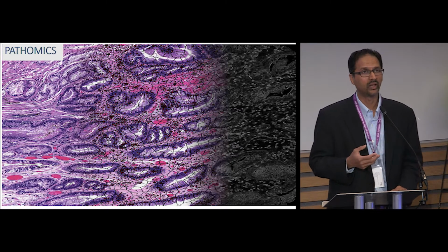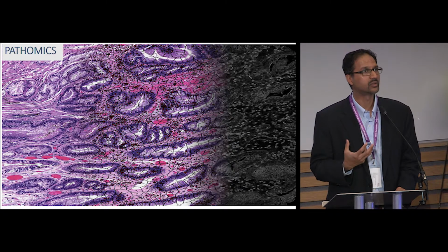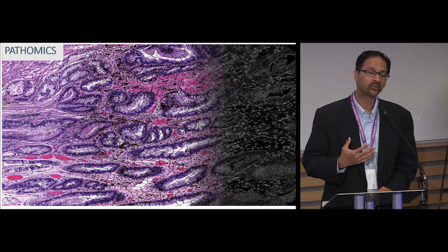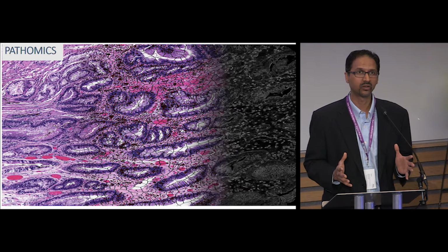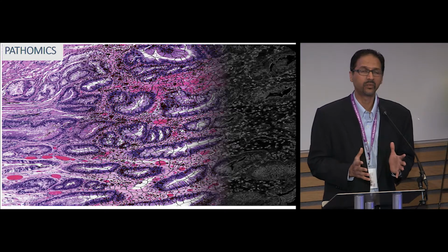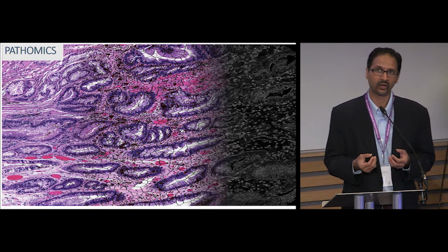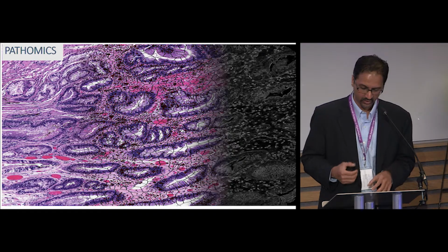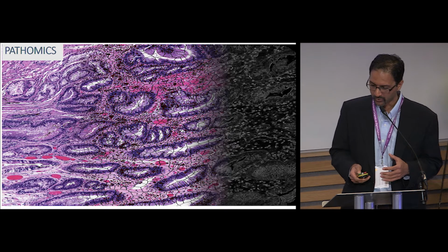It comprises hundreds, potentially thousands of sub-visual measurements that reflect what's happening in a very specific, quantitative, reproducible way, above and beyond the visual capabilities of the best pathologist, right? This is simply not tenable visually, because the number of sub-visual measurements you're getting is much more than can be discerned simply by looking at the slide. And so this represents a real opportunity.